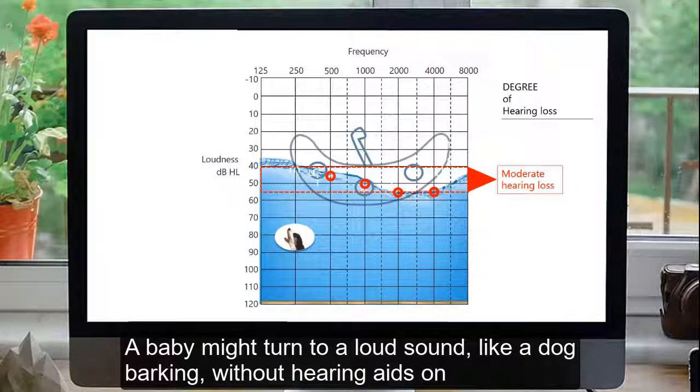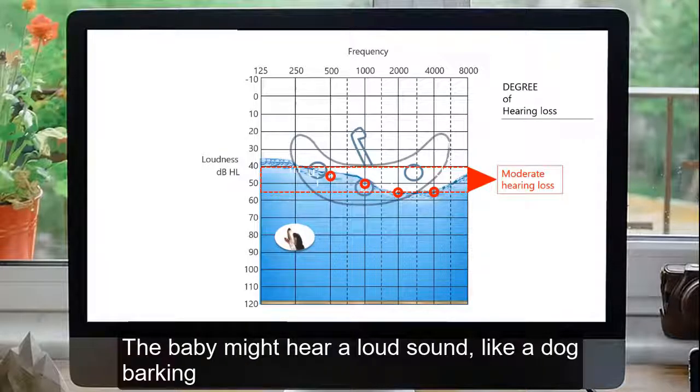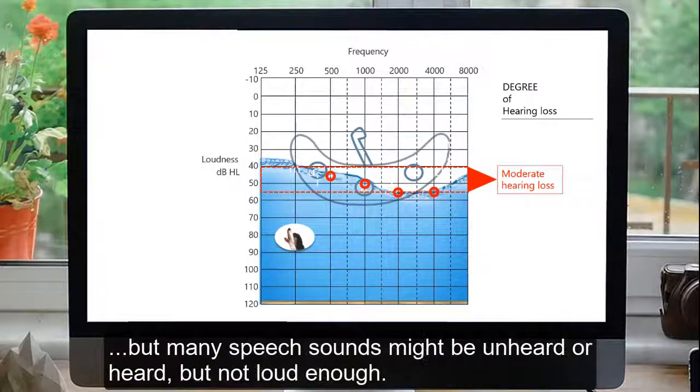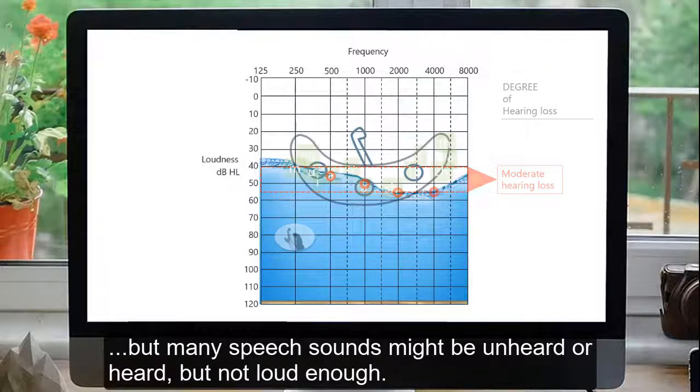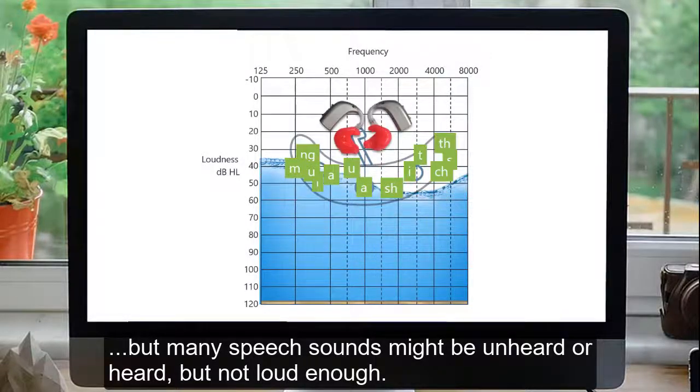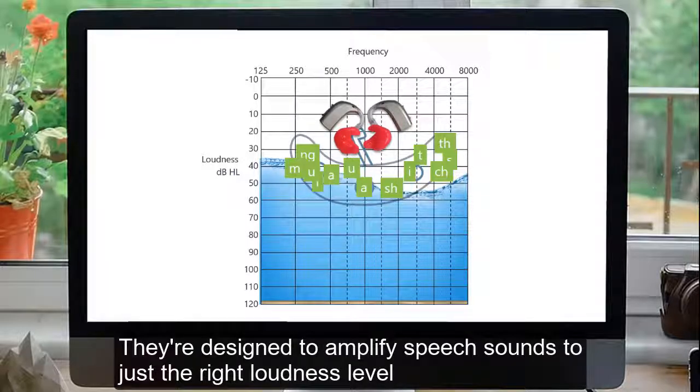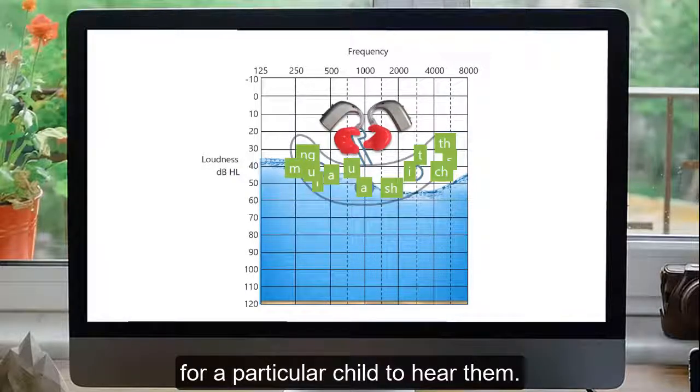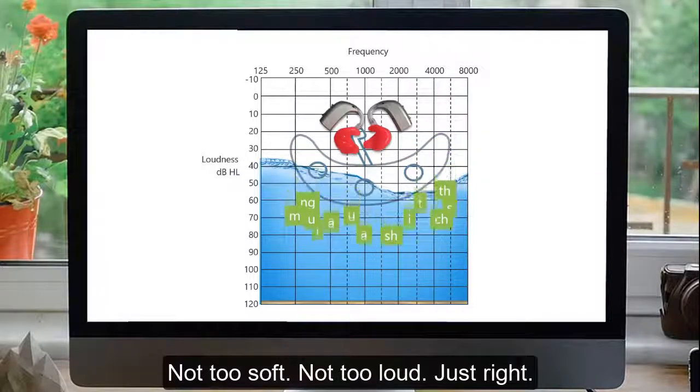A baby might turn to a loud sound like a dog barking without hearing aids on and trick the parents into thinking their child doesn't need their hearing aids at all. The baby might hear a loud sound like a dog barking, but many speech sounds might be unheard or heard but not loud enough. Hearing aids are set in a very specific way for each particular child. They are designed to amplify speech sounds to just the right loudness level for a particular child to hear them. Not too soft, not too loud, just right.